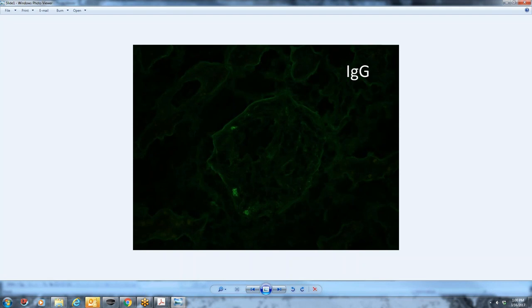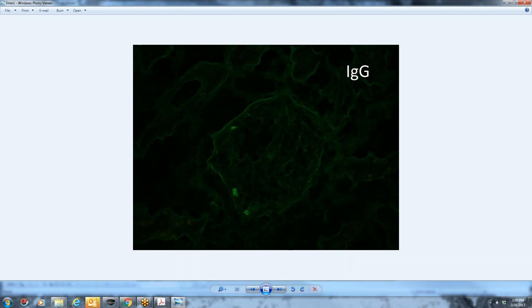Just to know what background protein levels, what you're going to see is a background and then anything above that would be considered positive for an immunoglobulin. So they have a great IF for human albumin that they use five times once each day. So we were hoping that if we had really good immunoglobulin evidence of immunoglobulin within the glomerulus that we could ask them to stain for the albumin to see if they kind of co-localized and you had positive IgG and then positive human albumin in the same glomerular tuft. In serial sections, then you could say, oh, you know, it must be an immune complex with the antigen being the albumin. So I think what we've been spoiled with generally in dog medicine and canine glomerular disease is that when we have immune complexes, they're quite large and you can see them very well in immunofluorescence and you can see them really well on EM.